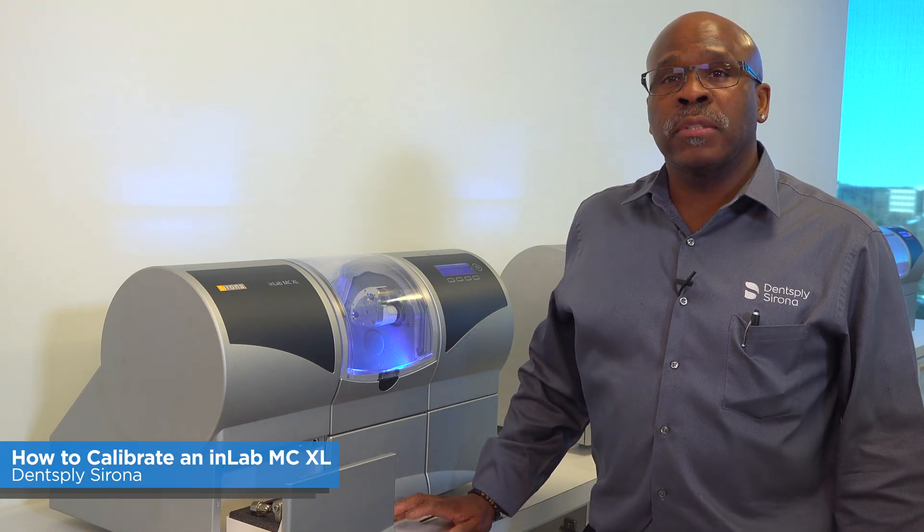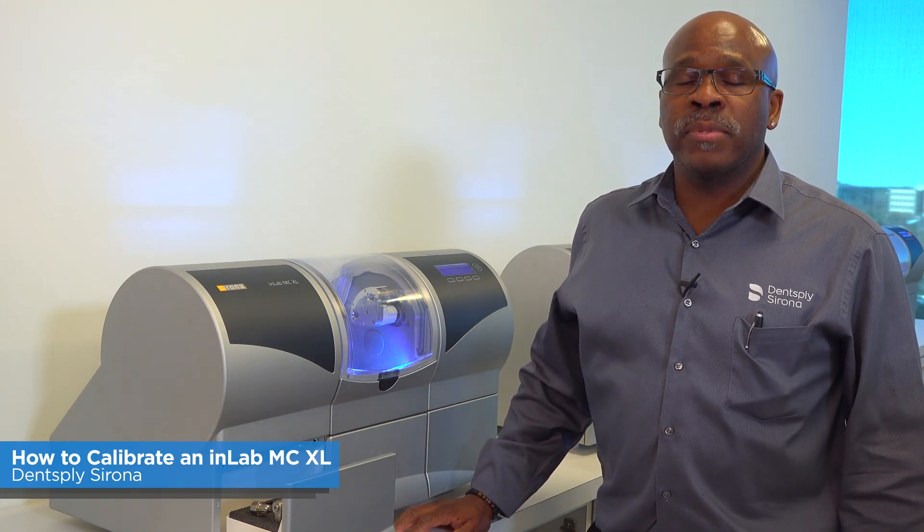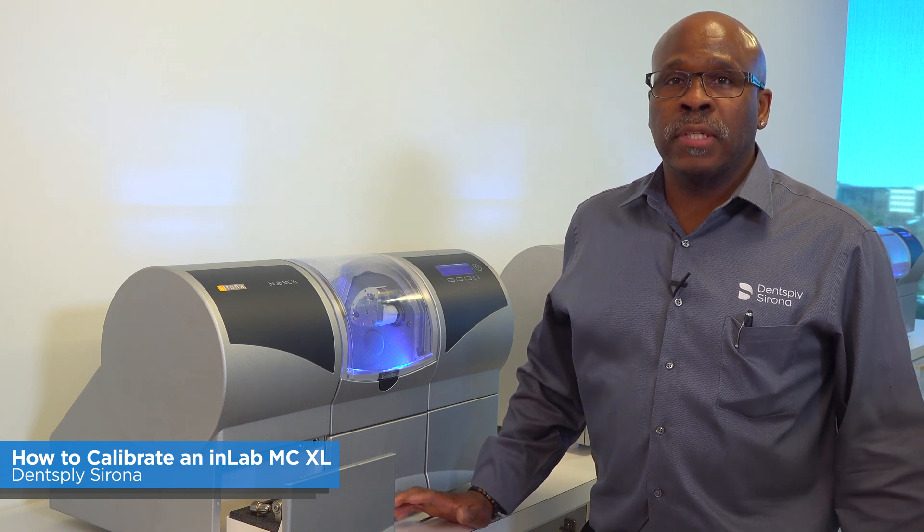Welcome to Tech in Two Minutes. Today we're going to discuss how to calibrate the NLAB MCXL. This is recommended yearly or as needed.